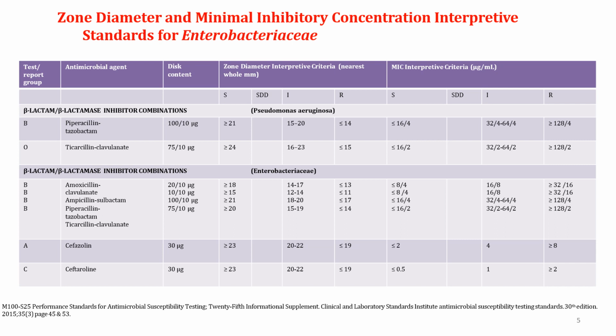Let us take an example. For example, E. coli from a sample, say urine, has an MIC of about, say, 1. This chart is the breakpoint chart given by CLSI, which stands for Clinical and Laboratory Standards Institute. So CLSI has given the breakpoints to interpret the MICs, whether it is sensitive, intermediate, or resistant, or whether it is SDD. Now, if from a particular sample you get the MIC as 1, the MIC is less than the susceptible breakpoint, so we will interpret that MIC as susceptible.